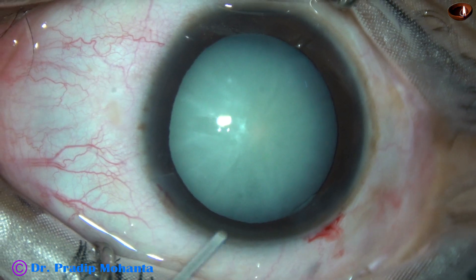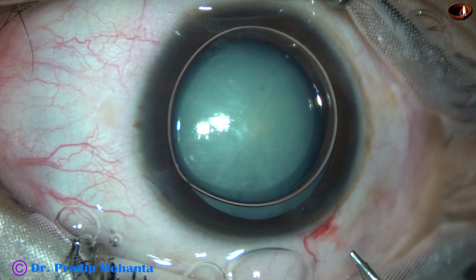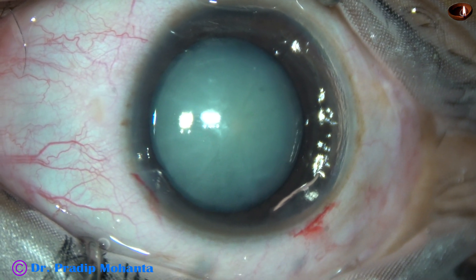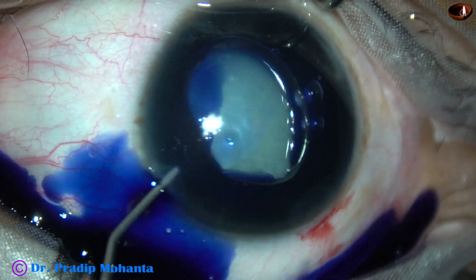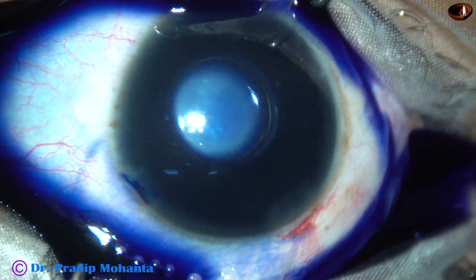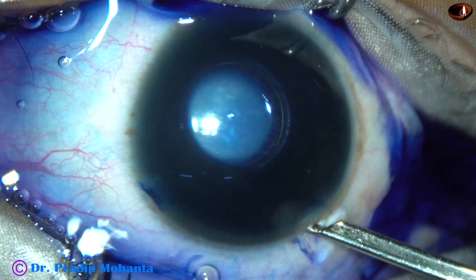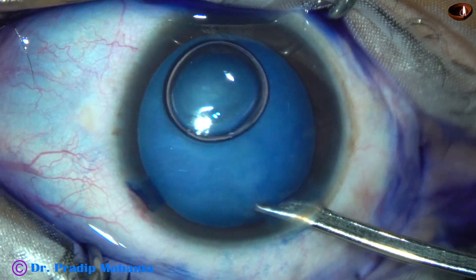And now, as I try to inject the air bubble, the air bubble tends to come out. However, the air bubble stayed at one moment. But as soon as I injected the dye, most of the air came out. And let us see if the corneal endothelium gets stained with trypan blue dye or not.